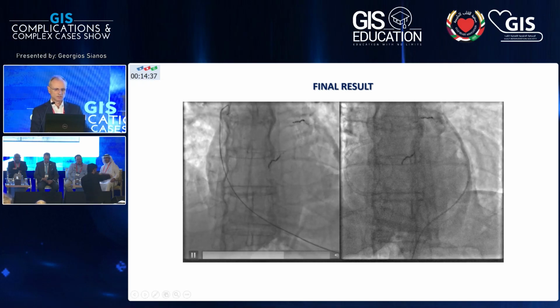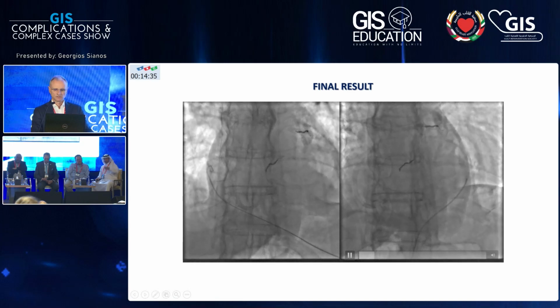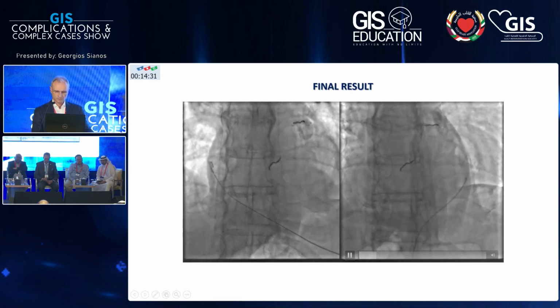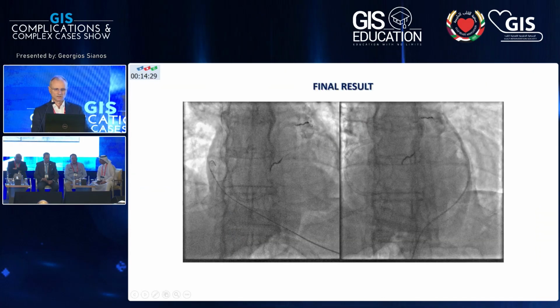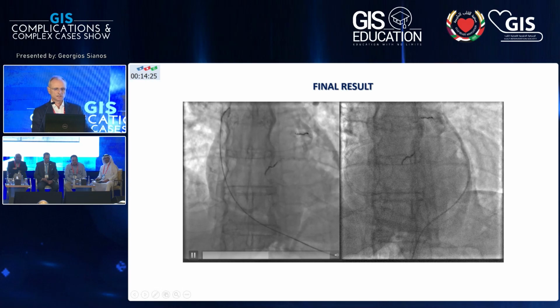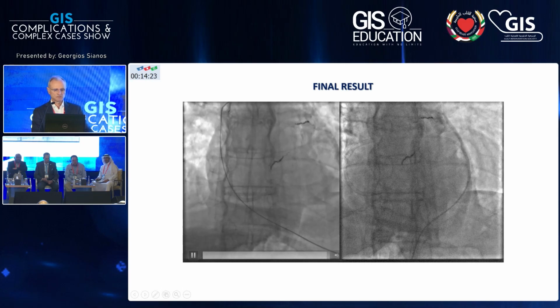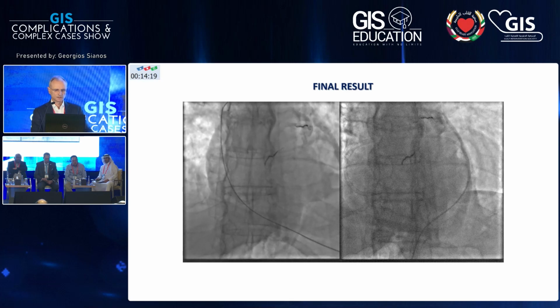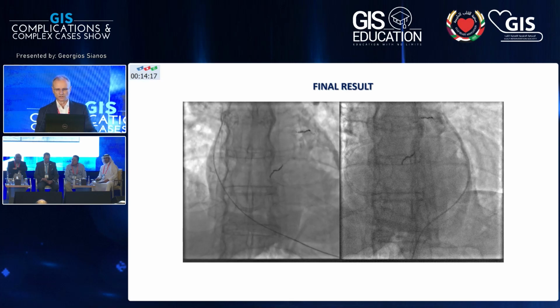This took some time, and you can clearly see, I believe, that there is a pericardial effusion now in this patient. So the procedure was being concluded by tapping, as you can appreciate here. And then the patient had an uneventful recovery. It was a complete sealing, and it was solved without the necessity to do any other thing.